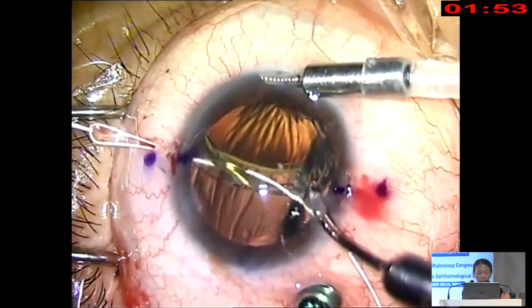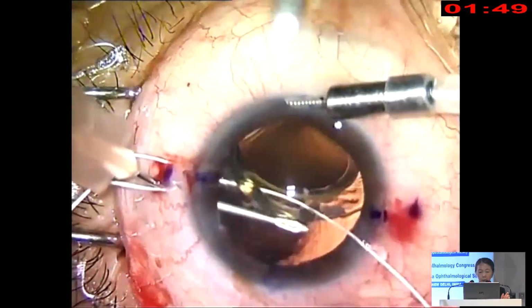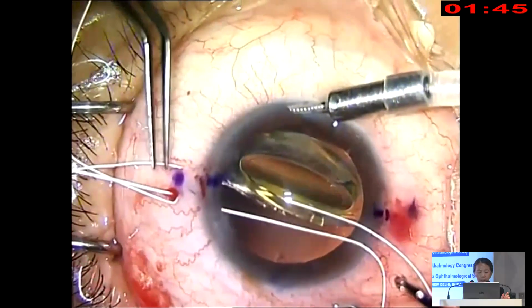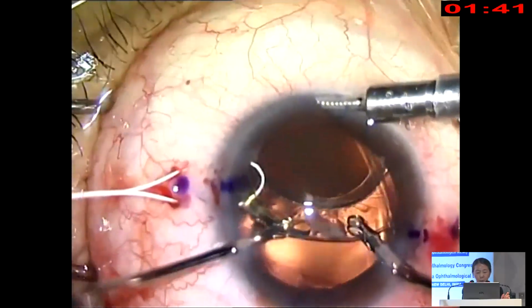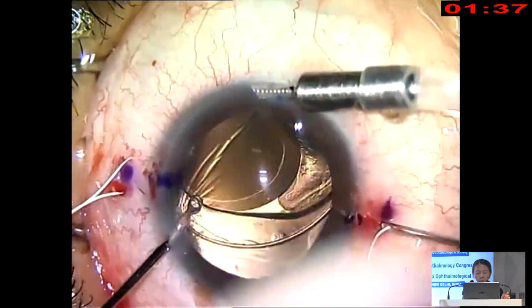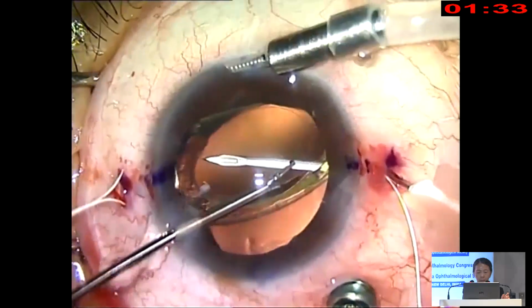Now you don't tighten too tightly, and try not to widen where you puncture through the capsular bag. So this goes above the complex, and you want to balance the torque created by your sutures on the opposite side because they are placed side by side. You could do one in front and one behind the 2 mm mark as well.